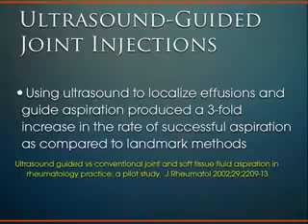But it's fairly blind, and you'll realize once you start using ultrasound guidance to do injections, and then you have to go back and do blind injections, which I had to do after fellowship, it's a little unnerving because now all of a sudden you can't see everything, and you can't see where the needle is, you can't see where you're going.